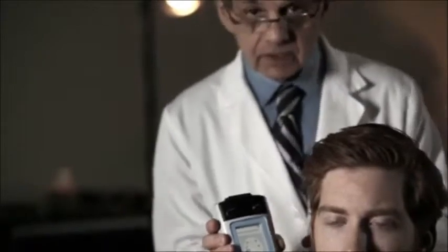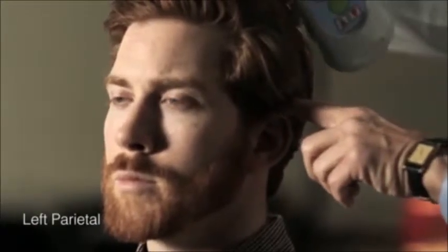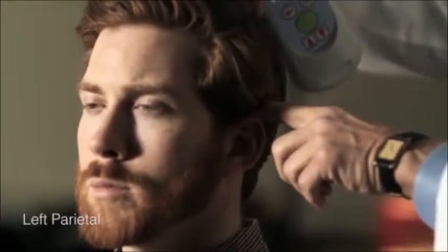Next we're going to go to the left parietal area. We select a point midway between the top of the ear and the coronal suture of the head, about in this area, again confirming a normal reading. The reference points are the top of the ear, the coronal suture, and the midline of the skull.